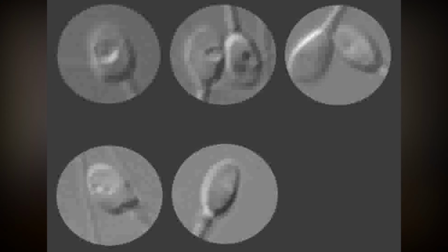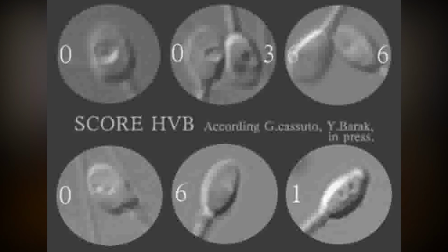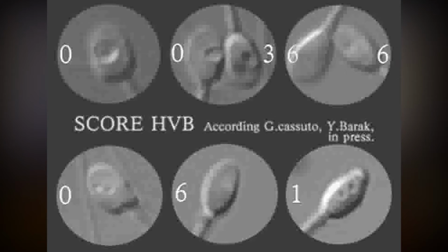And we established a new scoring of the sperm. According to this, this is a vacuole, this is another vacuole, and this is abnormal on the basis. This looks normal, and this is bad. According to this classification, in red you have the sperm you must avoid, to discard, and there is another.